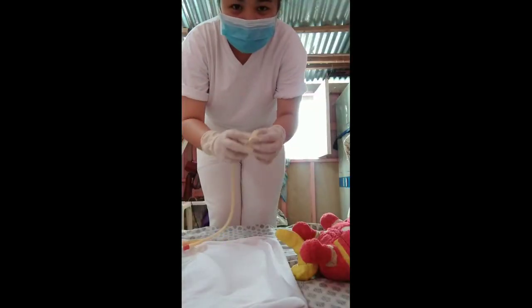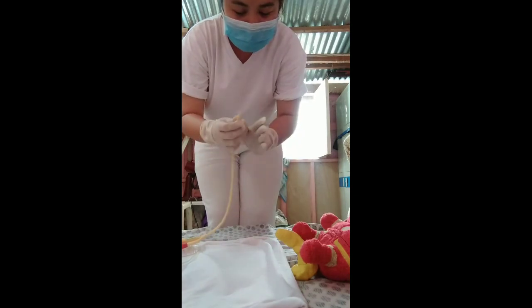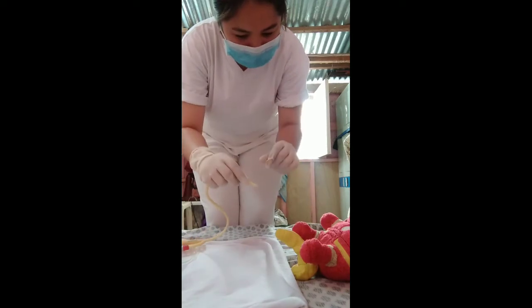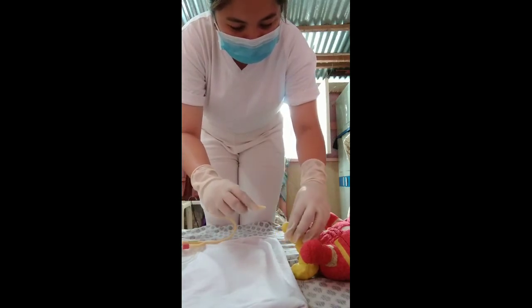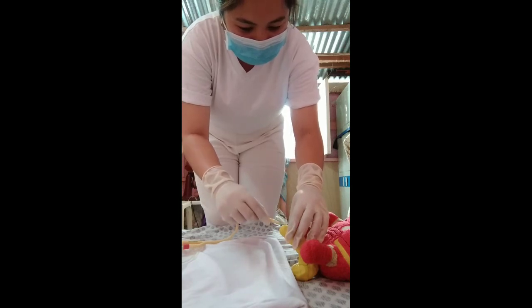So we are ready to insert the catheter into the urethra of the patient. May I ask you to inhale and exhale, sir, so that we can insert the catheter slowly and safely. Are you ready for me to insert the catheter, sir? So exhale.